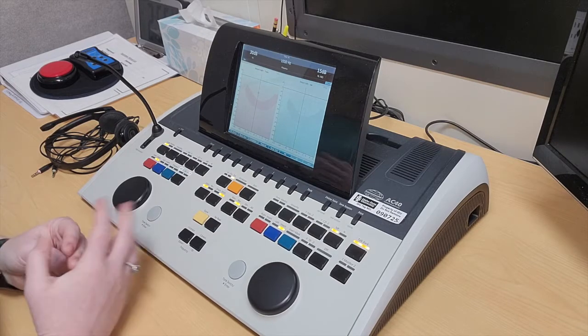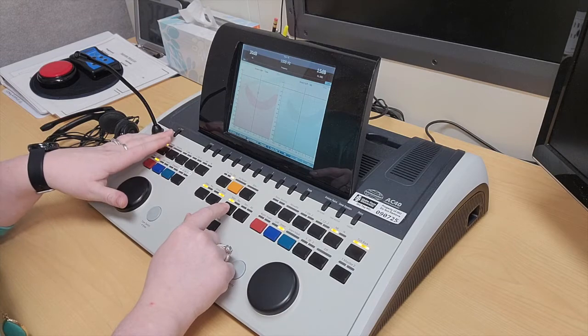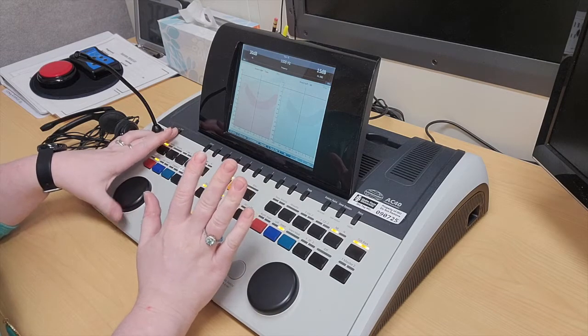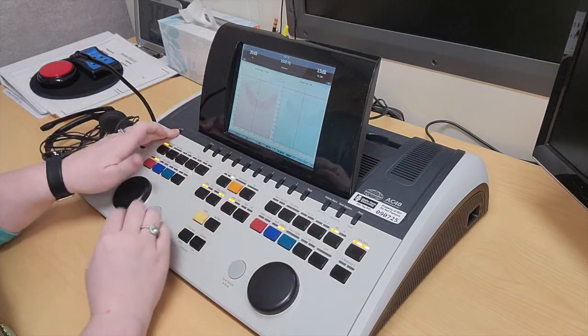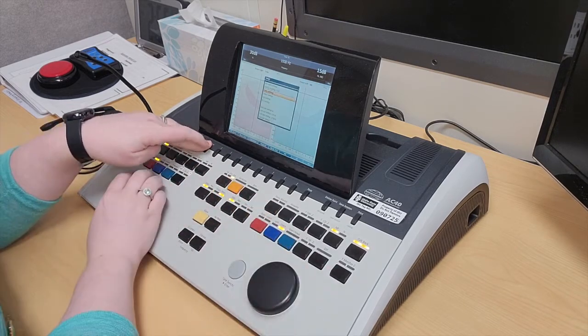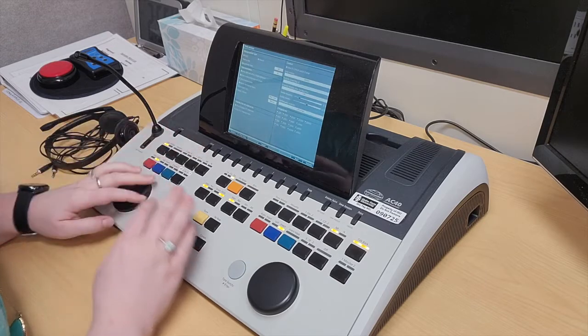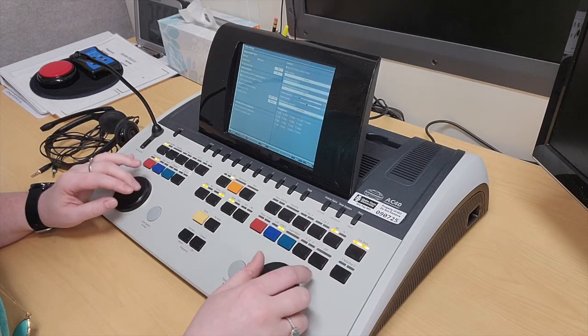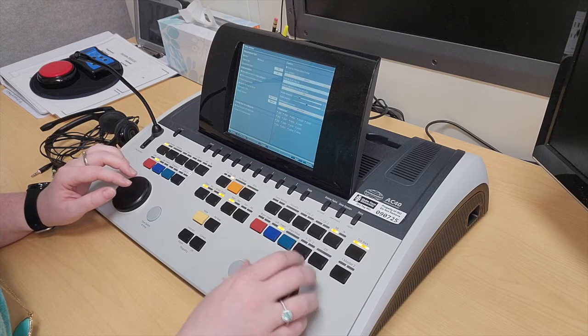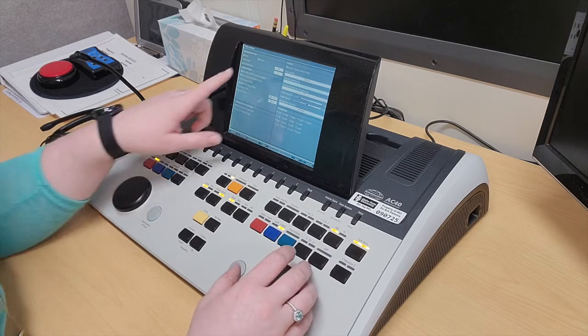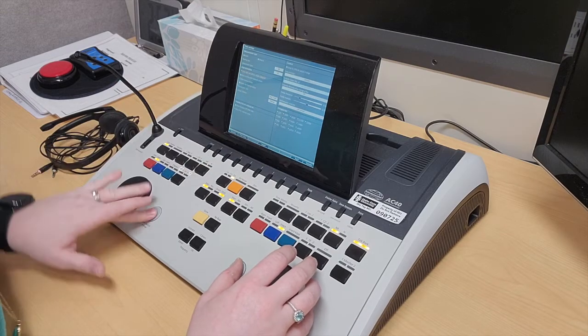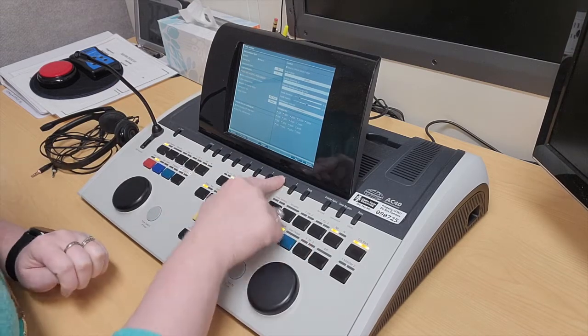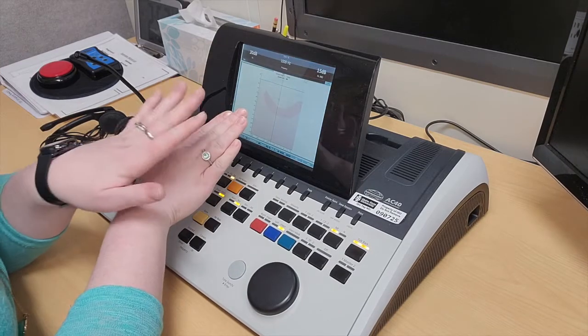For displaying, this is on two displays right now. If I wanted to put the audiograms overlapping each other, I would go to setup. Then I would use my wheel here to go to show right and left in a single audiogram, select it, and go back. Now they are overlapping.